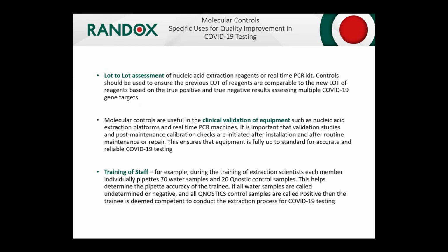That's fine. And then, in terms of internal quality control, obviously that wouldn't be the be all and the end all. You said you've used a mixture of the built-in controls within your assays, and also the third-party controls. Talk us through what other feathers to your bow you had in order to ensure the highest quality of standards within the lab?